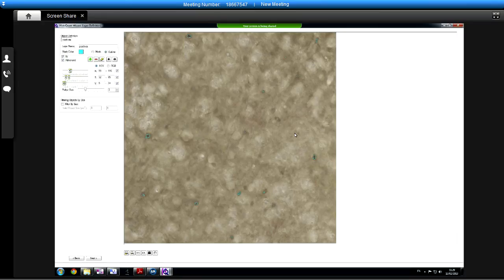So that there is considered as one object, that's one object, that's one object, etc. And there are tools at the bottom here like zoom in and zoom out, etc. if you want to see a bit more precisely what's going on, or click a bit more precisely.